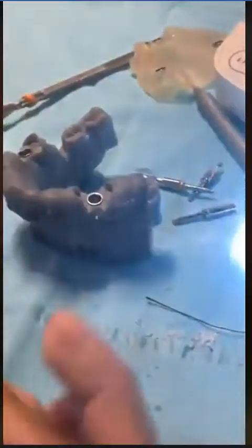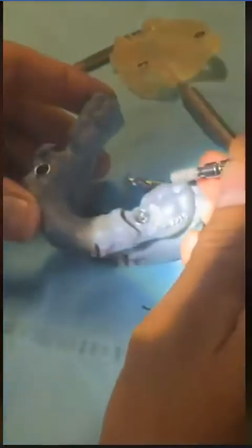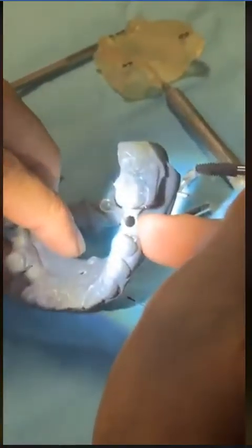Okay, now once you have this and we are finished with our pilot osteotomy, now you want to, if you're doing a Biomax implant from Blue Sky Bio, then you could use their entire system to place it fully guided. If you are not, at this point you're going to remove your guide and put your implant in without a guide, with a recommended company carrying tool and an implant. That's what you're going to do.